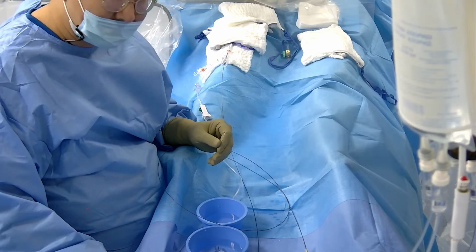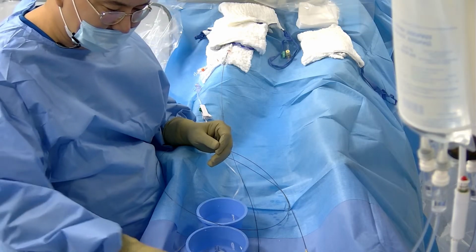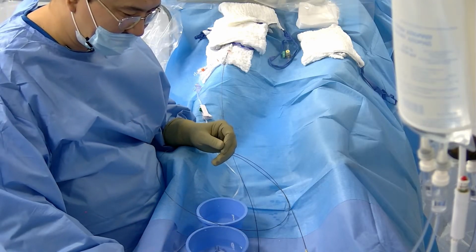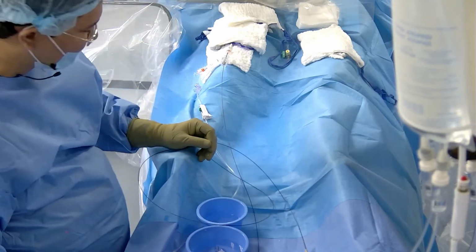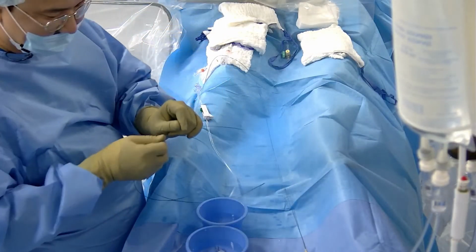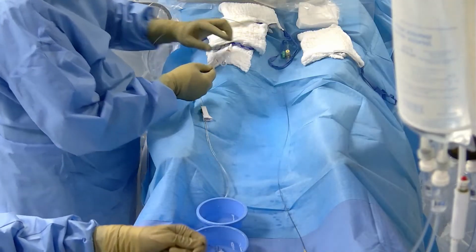And I realized the balloon inflation just at the time the complication came. That's why it's very important for the beginners, and not only for the beginners, for the usual practice, it's the alphabet, yes? If you are planning to do endovascular treatment, you should follow the rules.